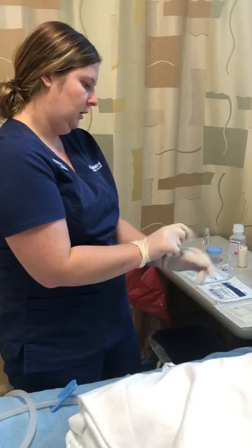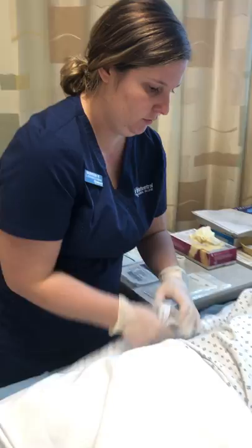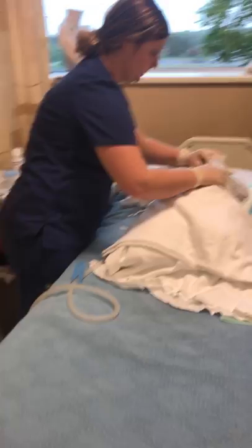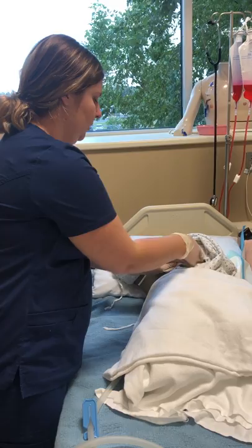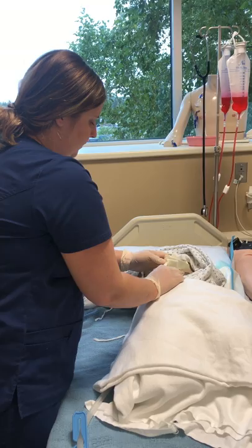Okay, once my gloves are on, I'm going to view her dressing here. Jennifer, I'm just going to pull your gown back a little bit, trying to keep her covered as much as possible. Then I'm going to remove the dressing. When I'm removing this, I'm going to anchor the tube in place and pull the tape from around, keeping the tube anchored.